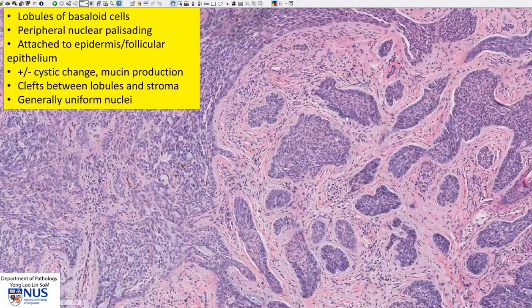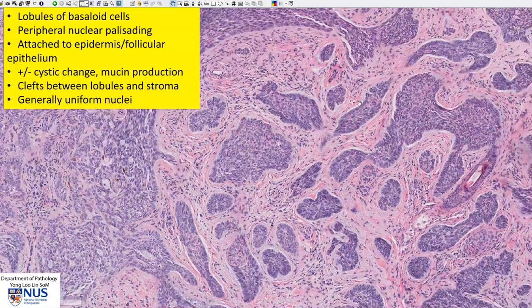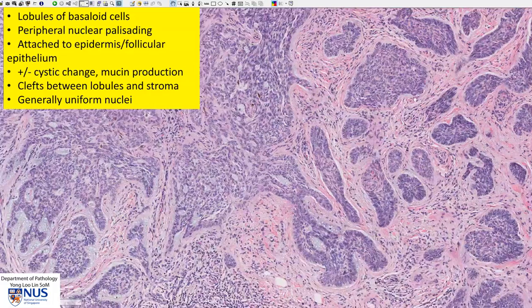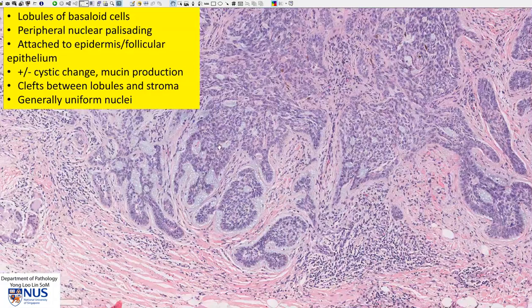With peripheral nuclear palisading, formation of clefts between the islands and the stroma, and some areas of mucin production.